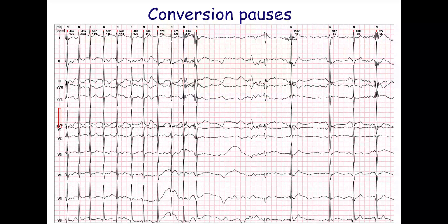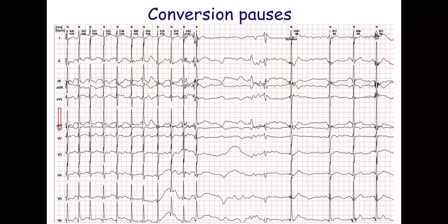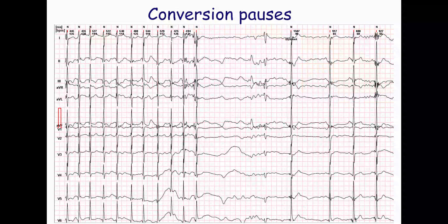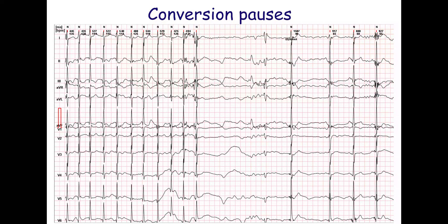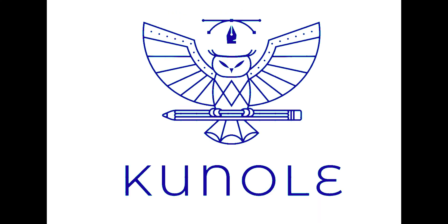Conversion pauses are a distinct type of sinus node dysfunction. They occur after the termination of atrial fibrillation, atrial flutter, or supraventricular tachycardia, before sinus rhythm is restored. This ECG shows a 3.7-second conversion pause after the termination of atrial fibrillation. Conversion pauses may be present even in the absence of other signs of sinus node dysfunction.